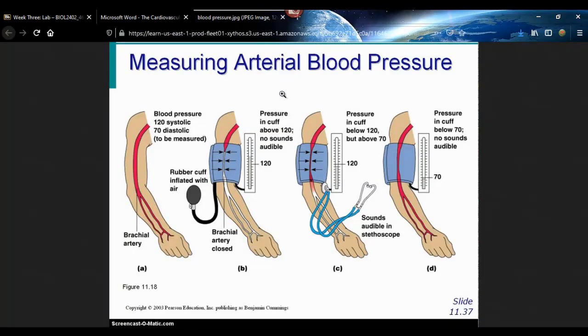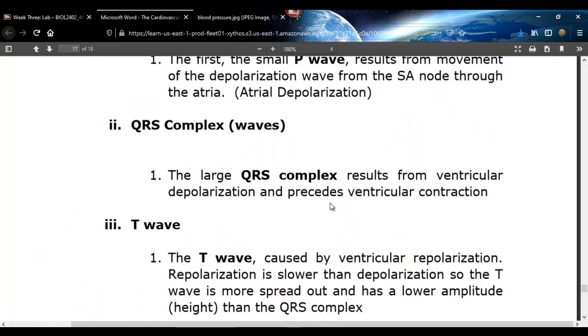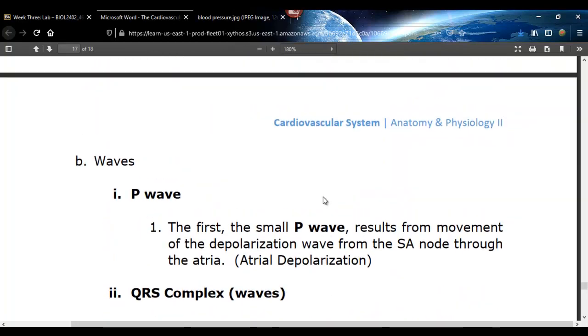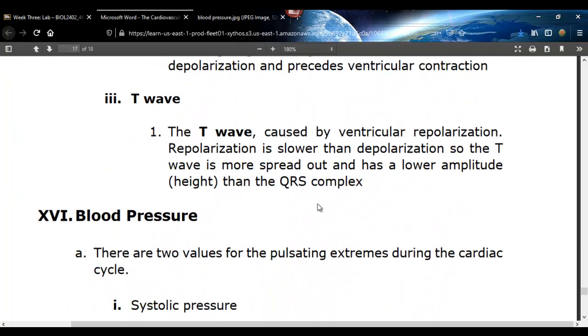Very simple, basic EKG. That's not a 12 lead, which has all different levels and all different views of the heart. A standard EKG could be like 3 leads. It's left and right wrist, and then left leg. Anyway, that's it. You have to know what each wave represents, of course, and then kind of what one looks like.